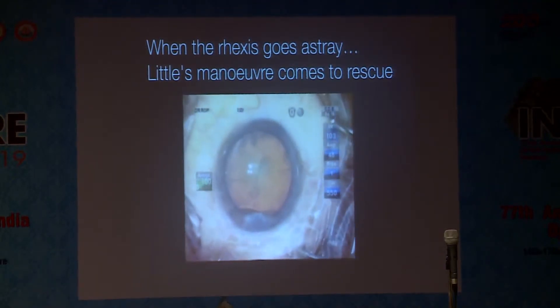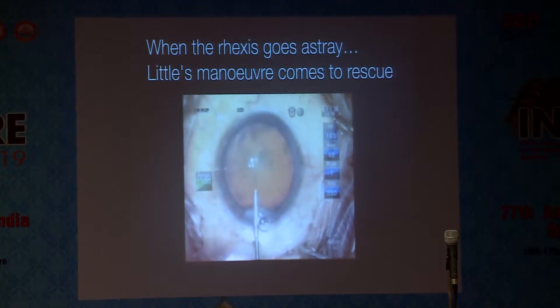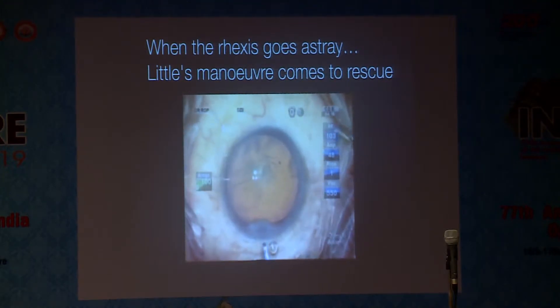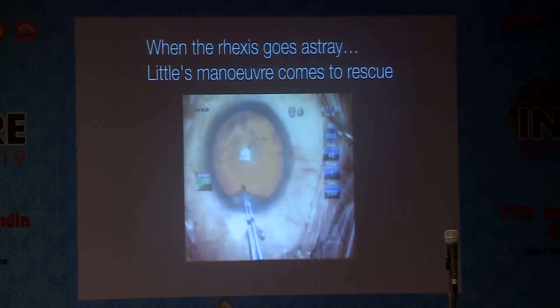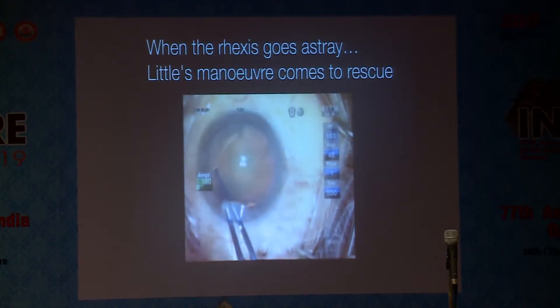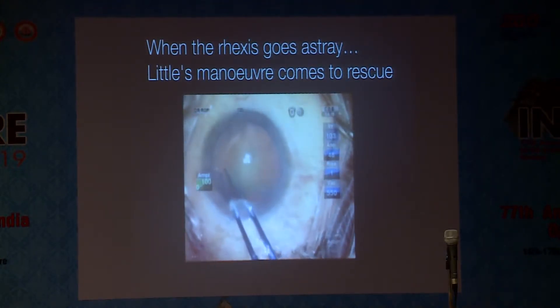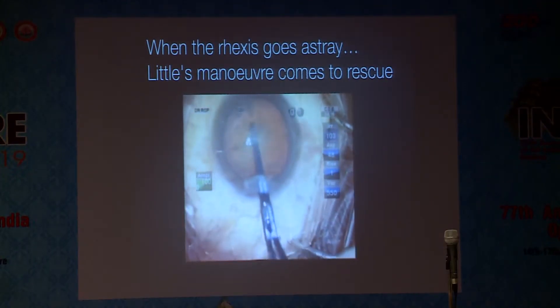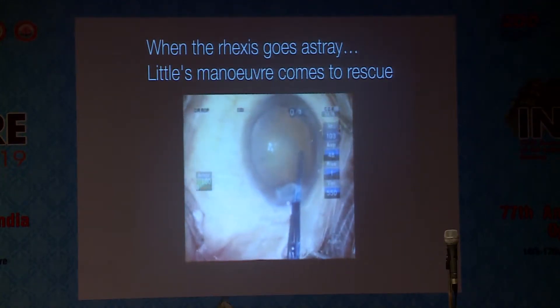We deepen the AC. After deepening the AC, the next thing which needs to be done is we need to make the flap within our control. We make it slightly concave. Then we go as close as possible to the end of the flap and pull it in such a way that the vector forces — the resultant vector forces — make it go that way.